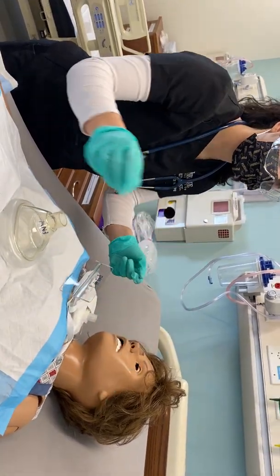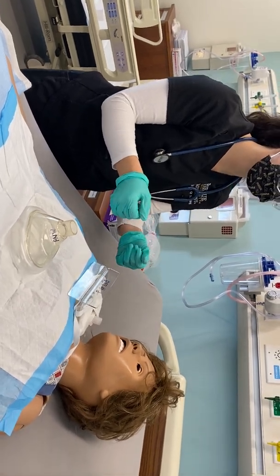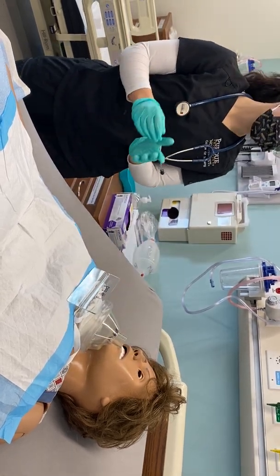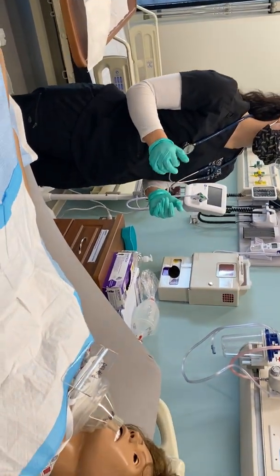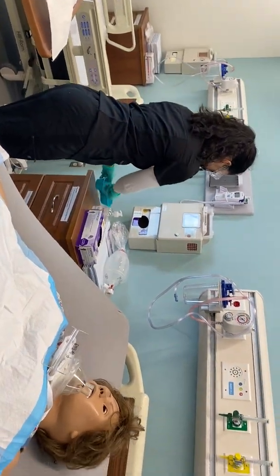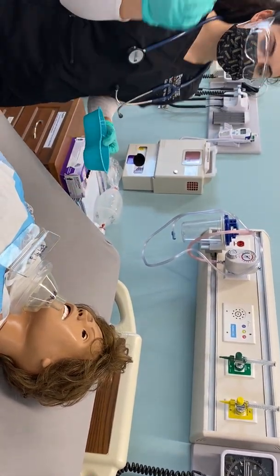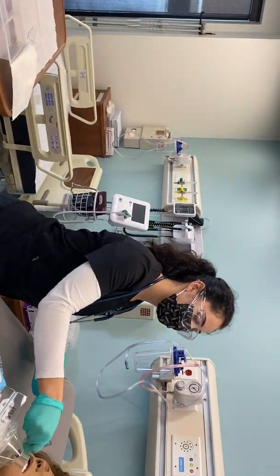Now I'm just going to have you move your head. Can you flex your neck to make sure it's comfortable? Okay, perfect. I'm also going to reapply your oxygen. All right, great, thank you. Now that we're done with that, I'm also going to complete oral care at this time as well. So we're going to do some oral care. Then I would discard of this. Do you need anything for your lips? There you go.